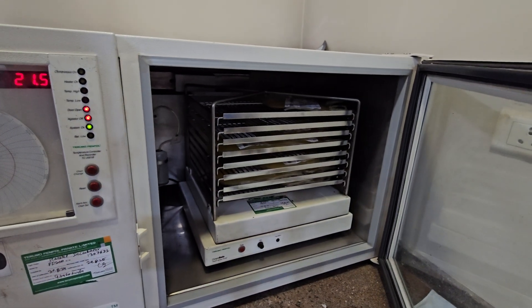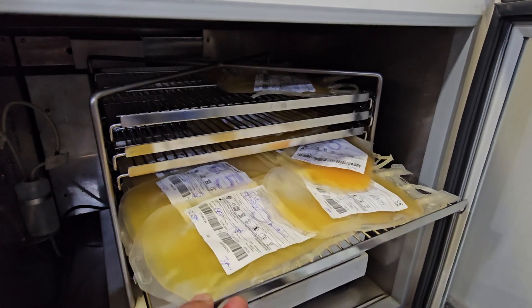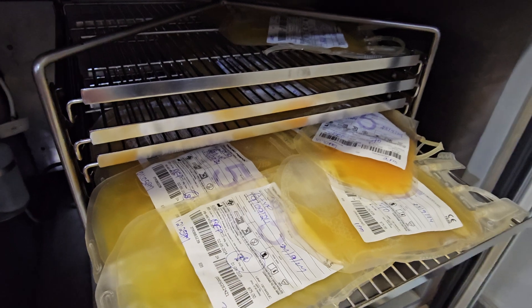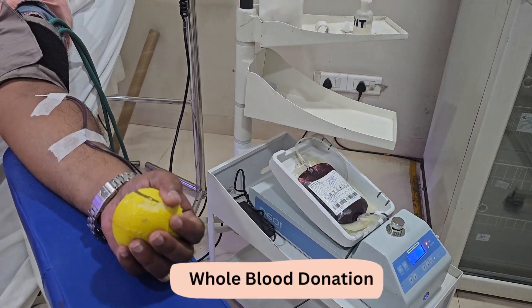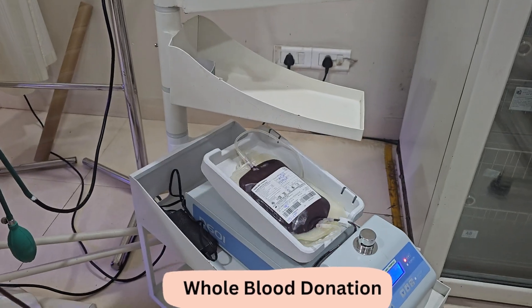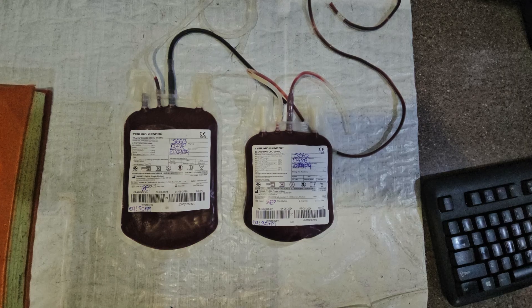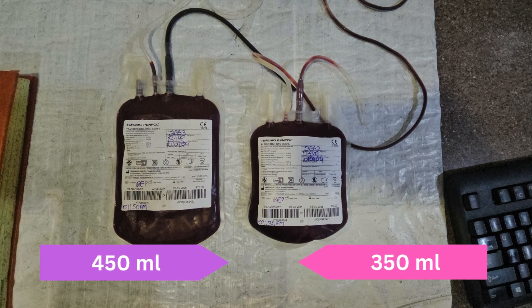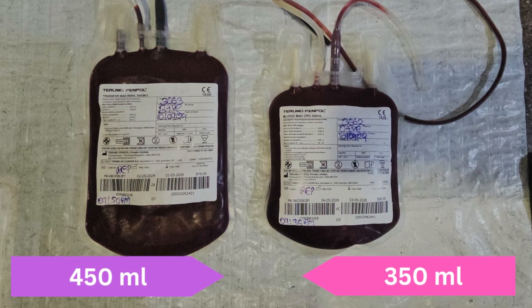In this video, we will discuss how to prepare random donor platelets. From the donor, whole blood is collected over 6-8 minutes. The amount varies from 450ml to 350ml depending on the body weight of the donor.